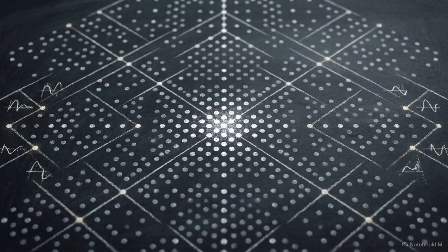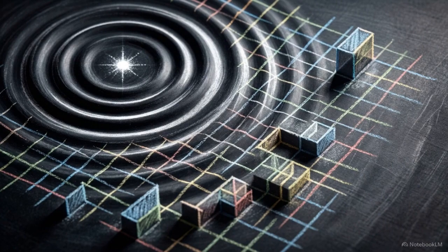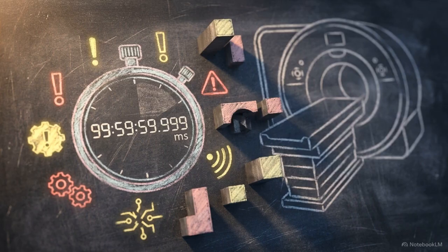In the digital realm of K-space, localized errors do not exist. A single corrupted data point or a missing high-frequency variable guarantees a distortion across the entire image. Pushing an MRI for maximum diagnostic speed requires specialized protocols, but extreme speed inherently amplifies these underlying physical vulnerabilities.